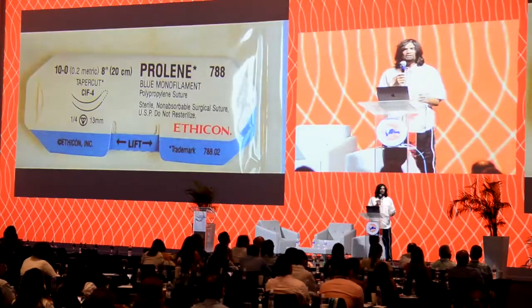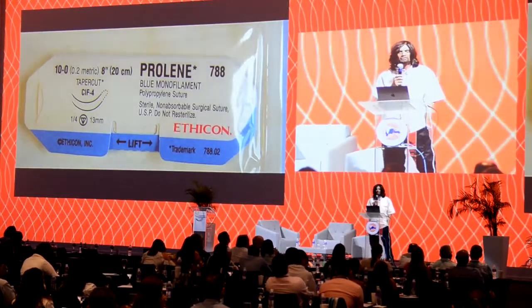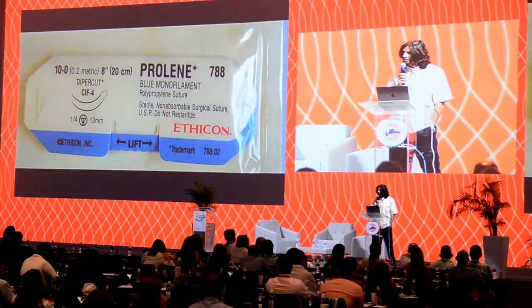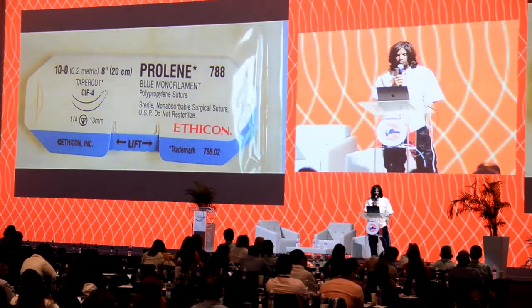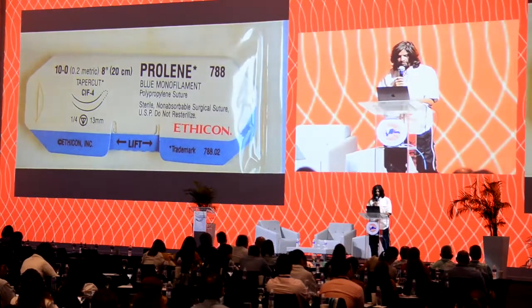So what do we need to do this? Well, we don't need a lot. Actually, I truly think this is something that many cataract surgeons can tackle, especially a simple iris defect to close. I still like the tried and tested CIF4 needle on a 10-0 Prolene. I think the larger bore sutures tend to create more suture holes and cheese wiring. So this is what we typically use.